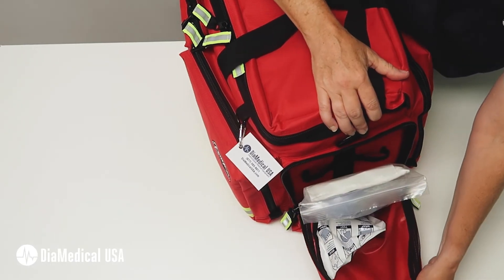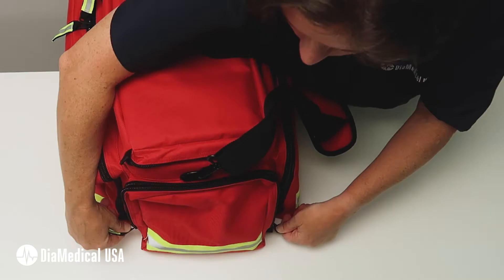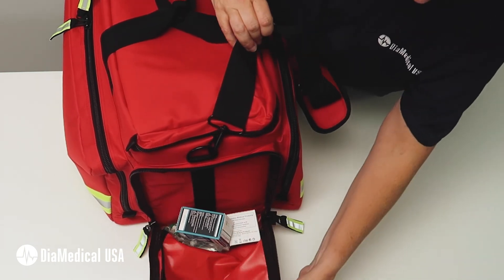The right side pocket contains an obstetrical kit with everything you need for pre-hospital childbirth. The left pocket has a glucometer with strips and lancets so you can quickly check the patient's blood sugar.